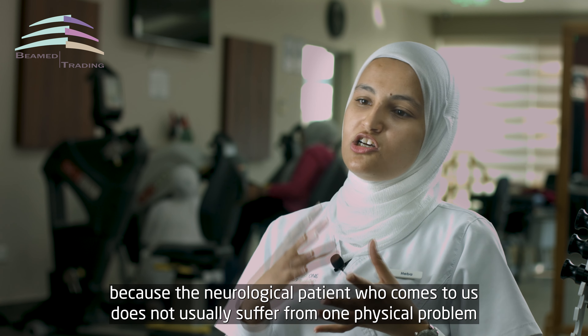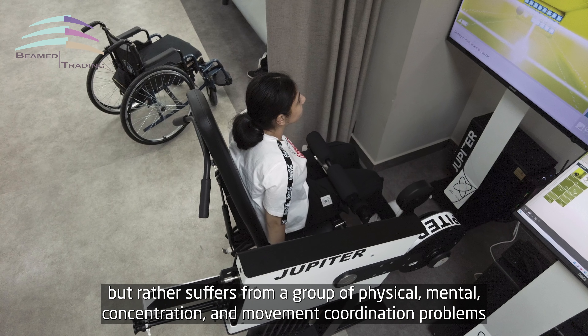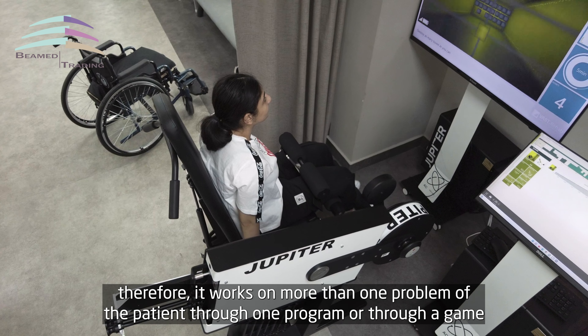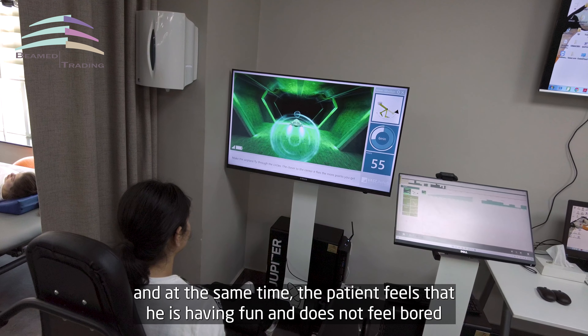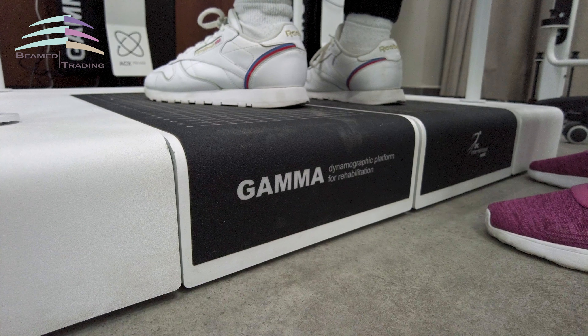مريض الأعصاب ما بشكي من مشكلة واحدة جسدية، بشكي من مجموعة مشاكل جسدية وذهنية: مشاكل تركيز ومشاكل تناسق حركي. فهي بتشتغل على أكثر من مشكلة للمريض من خلال برنامج واحد أو من خلال لعبة، وبنفس الوقت بيحس المريض أنه متسلي وما بيحس بالملل.